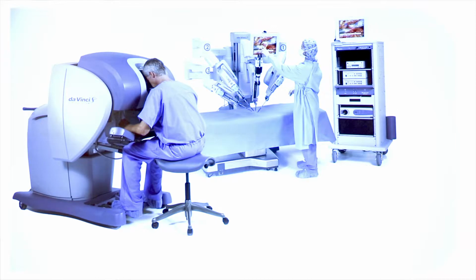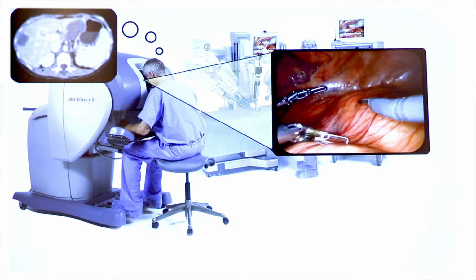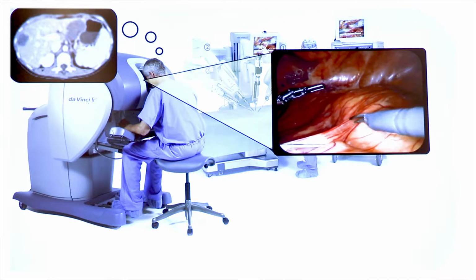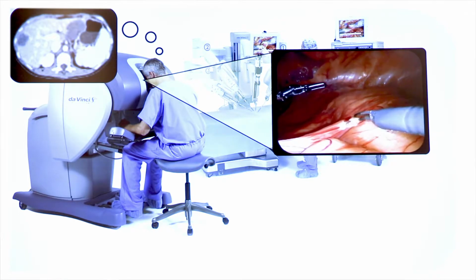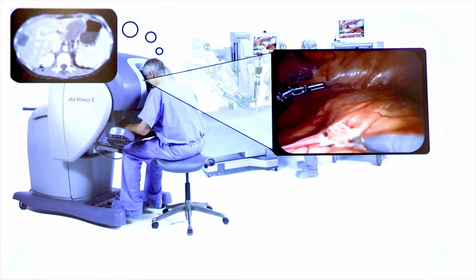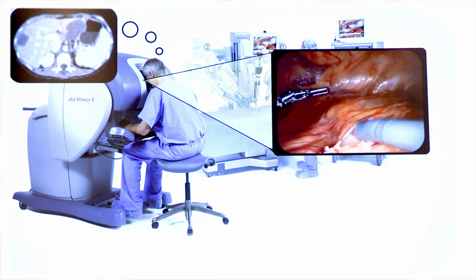Our project here is to really leverage the Da Vinci robot to create an image guidance system for partial nephrectomy and also other surgeries. The current challenge with these types of surgeries is the problem that Dr. Clayman brought up earlier this morning: as a surgeon, while you're operating, in order to use preoperative images, you have to think about these CT 2D images and all of these slices that you've seen and try to put them together into a 3D model in your mind and then match them to the anatomy you're seeing through the endoscopic camera, right?